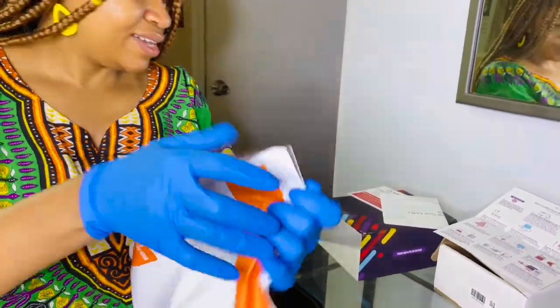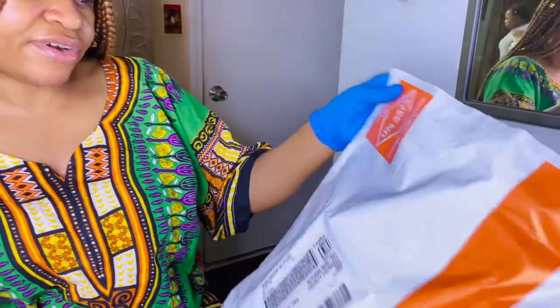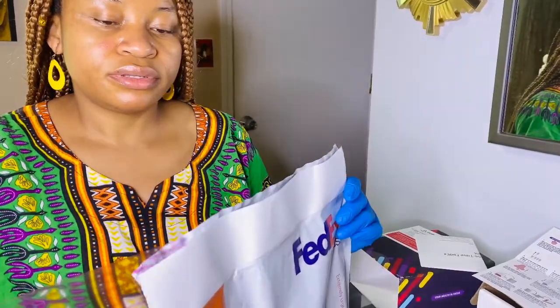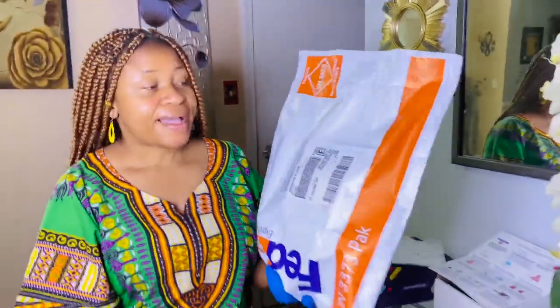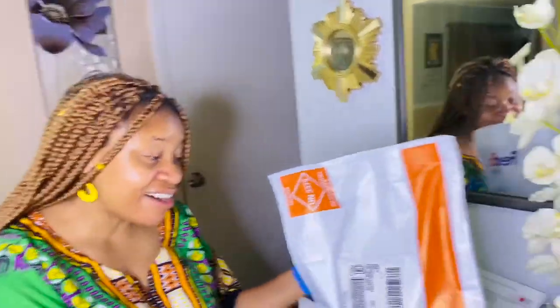All right. Okay, they already put the stand right. Okay. And then I'm gonna seal this up. It's all sealed and done. I'm just gonna send this back to Labcorp. Our COVID test is done. All you have to do is put your order through and then read the instructions in the kit and do exactly as it says, and you'll be good to go.